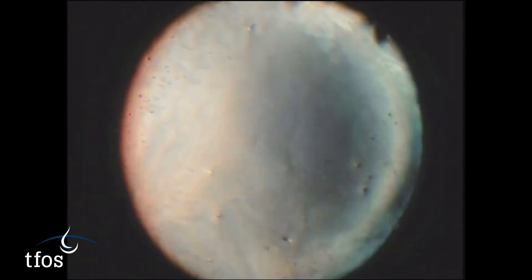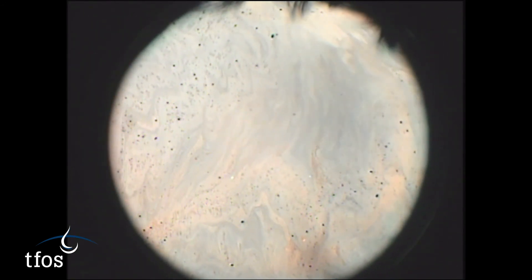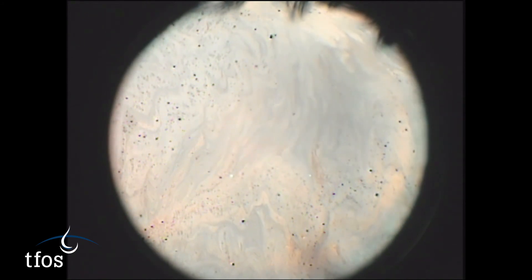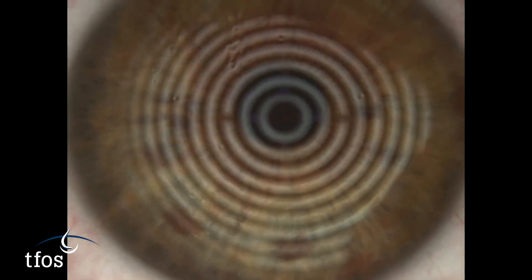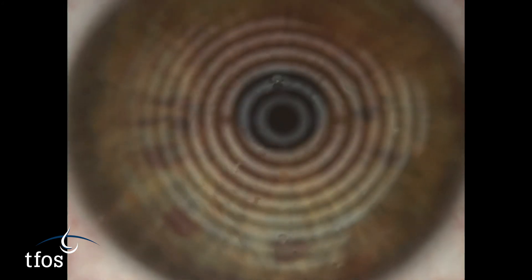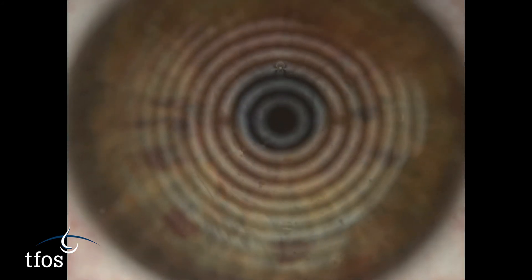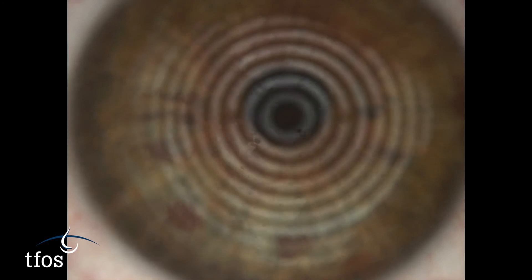Dedicated instruments that provide full-field, dynamic, interferometric imaging are also becoming more widely available in the clinical setting. The lipid layer can also be visualised using topographic instrumentation by focusing slightly anterior to the Purkinje images of the mirrors. While this allows for dynamic evaluation over a wide field, imaging is limited to the illuminated areas and not the dark gaps in between.